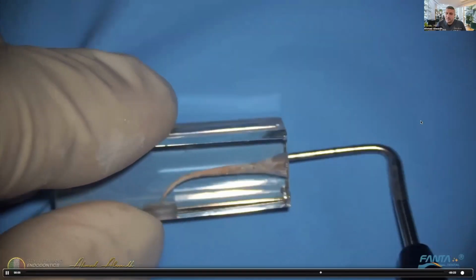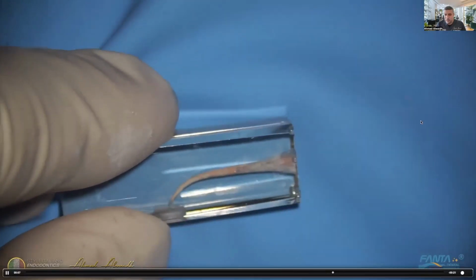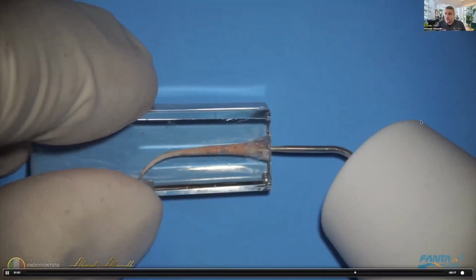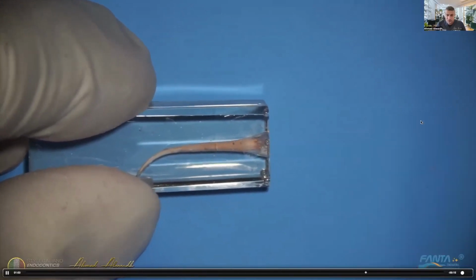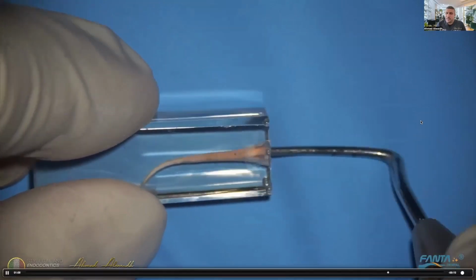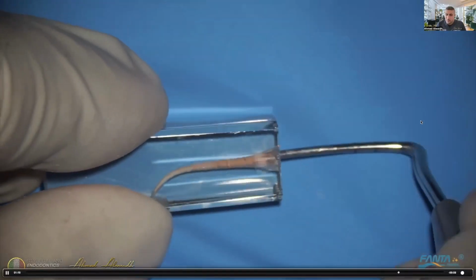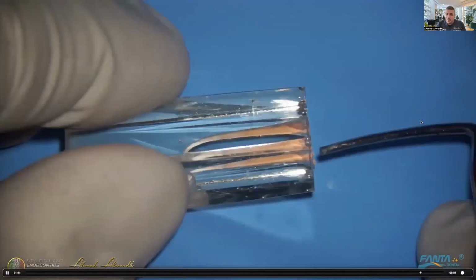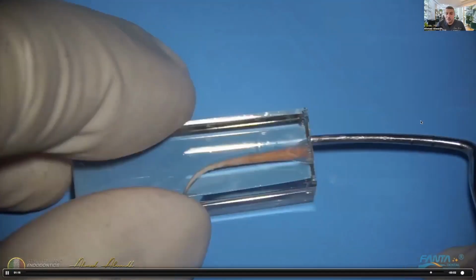And then we will do the coronal third. Most importantly, we compact until the gutta-percha cools down to prevent the shrinkage. Now, we have a complete three-dimensionally obturated canal. All the anastomoses, all the complexities of the canal should be obturated.